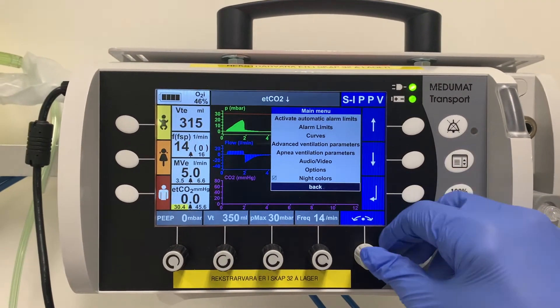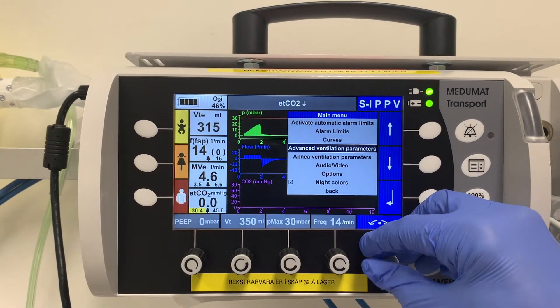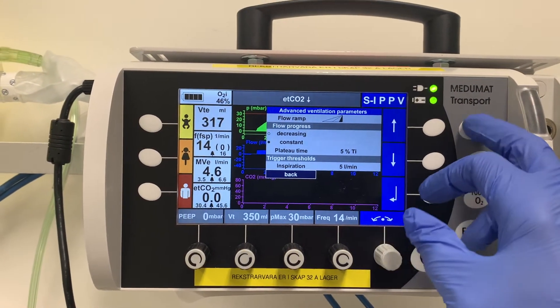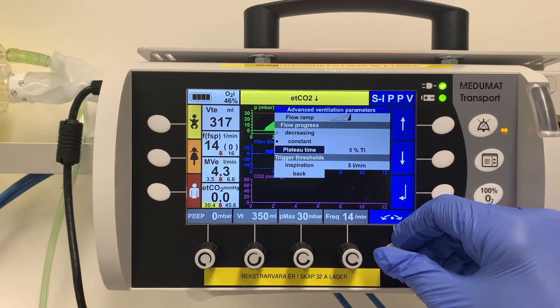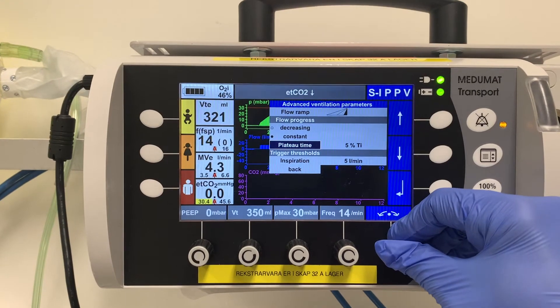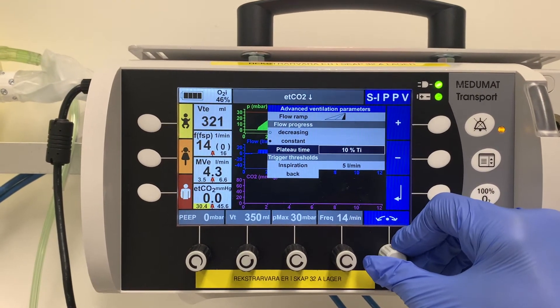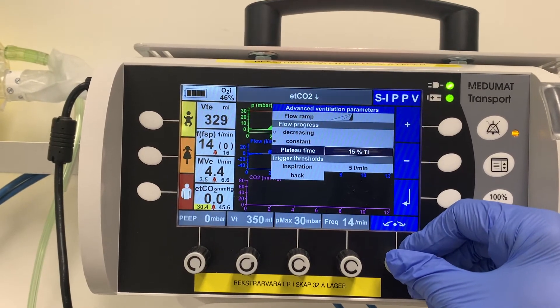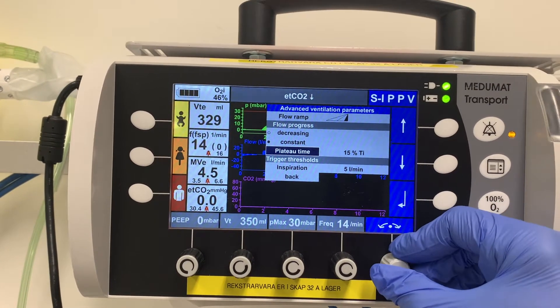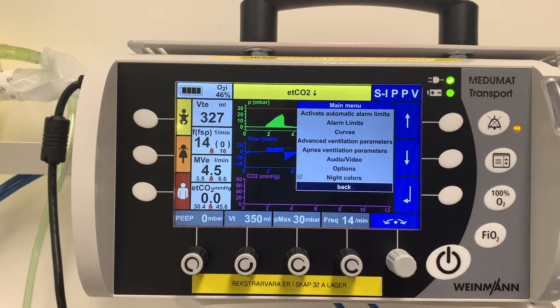To measure plateau pressure, you need to go into the menu button, then into advanced ventilation parameters. From there, set a plateau time — an inspiratory pause of about 15% — then go back.